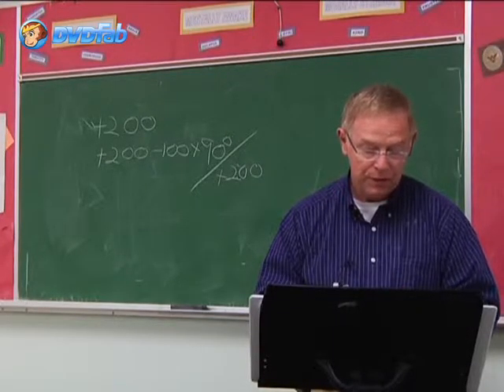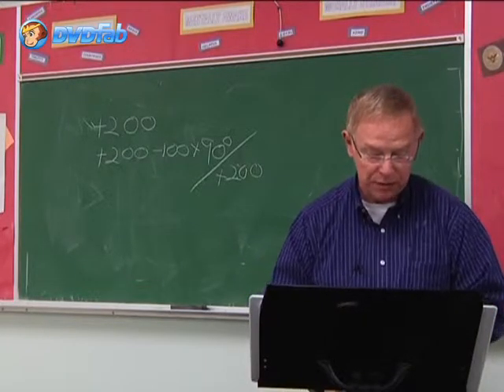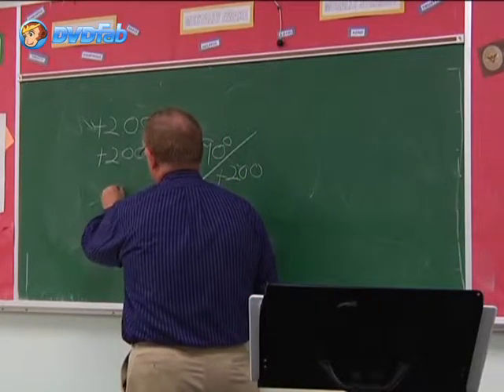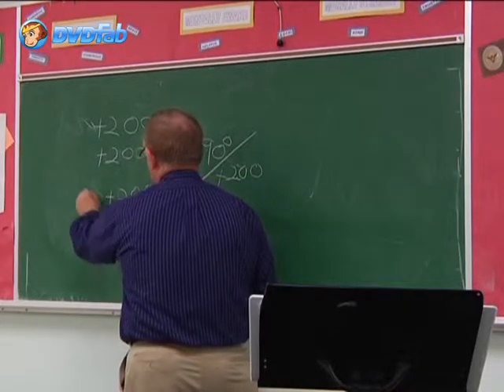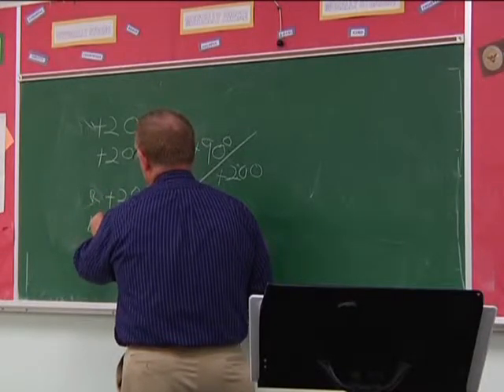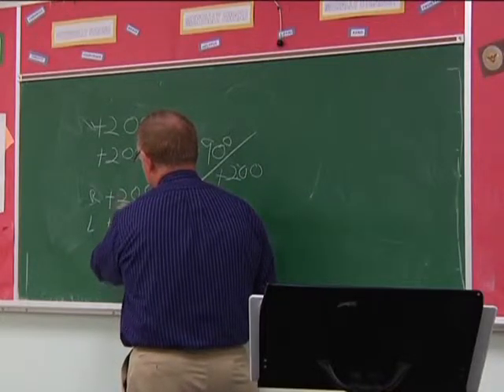Number 2, if the difference in sphere power between the right eye and left eye is more than 0.75, then reject. So if the right eye is a +2 and the left eye is a +1.25, that's 0.75 difference.